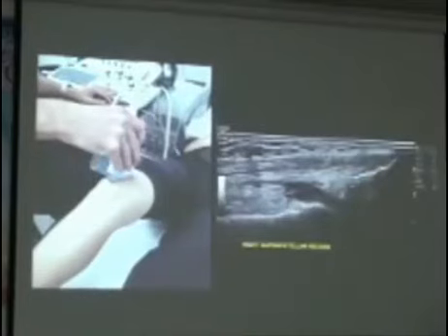Looking at the suprapatellar recess, once again, just with the transducer in the longitudinal plane.